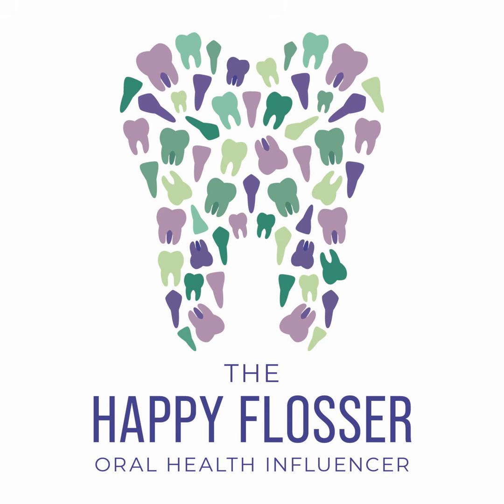This will help you still obtain the correct image without being in the way. If your patient has mandibular tori, place the sensor between the tori and the tongue. And sometimes if your patient has missing teeth, you can use a cotton roll if those missing teeth are making it harder for you to get an image of the teeth on the opposing arch. So the cotton roll will provide something for the patient to bite on.